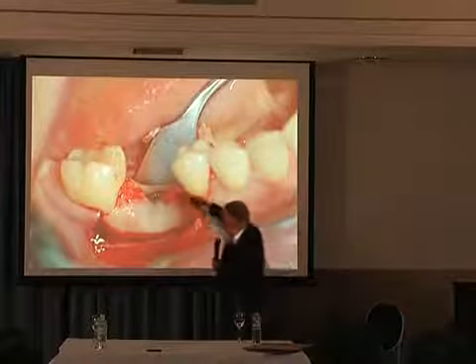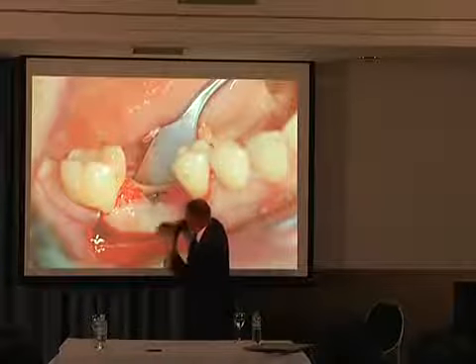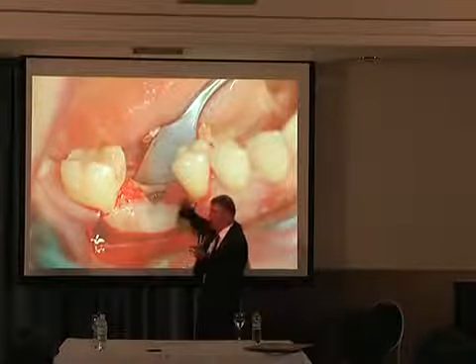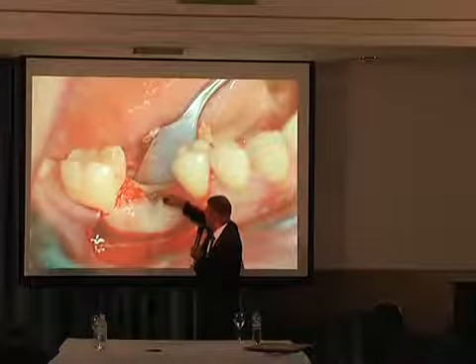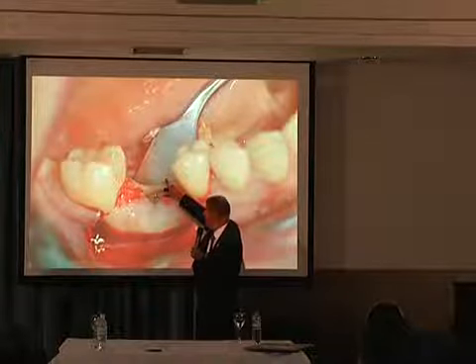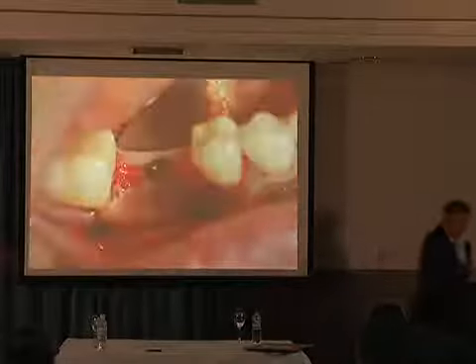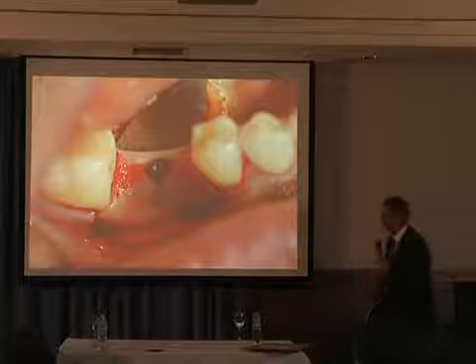So look carefully at the slide. If we screw the implant in like this, it is placed 0.5 below bone level on the cortical plate, and on the lingual plate it ended up 1, 2, 3 millimeters below bone level, depending on how much we split and tilted it. And the platform shifting concept: the abutment is smaller than the outside diameter of the implant, like a tulip, and it shifts the biological width, which is more or less the distance from the bone level to the beginning of the prosthetic superstructure, from a vertical to a horizontal dimension. Just one word, platform shift. He said a lot, but told me to say only one phrase: platform switching.